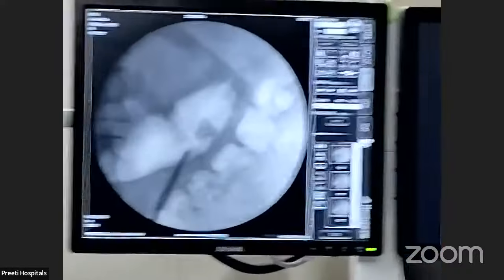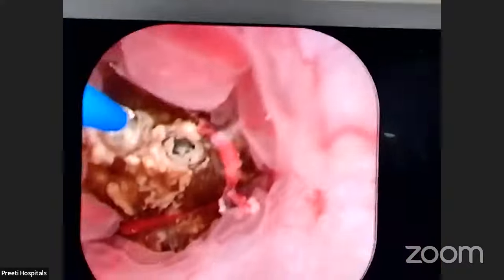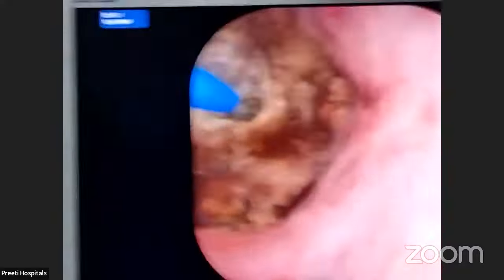See, we are sucking, and at the same time we are manipulating. See, this is the picture. See on the picture now. So in this case, I got trouble, but I came out with experience. Respiration stop, please. Reduce. Now where is the sheath? It is inside. So intermittently we will suck it out. Intermittently, you will see that the suction effect is happening.